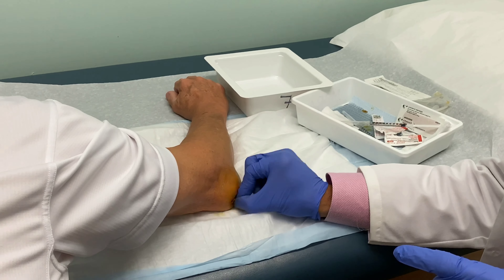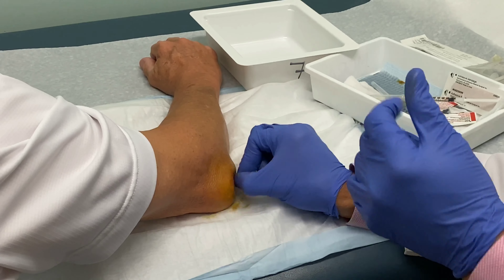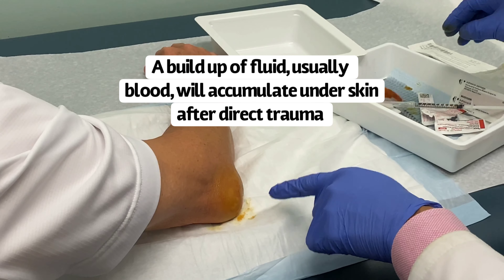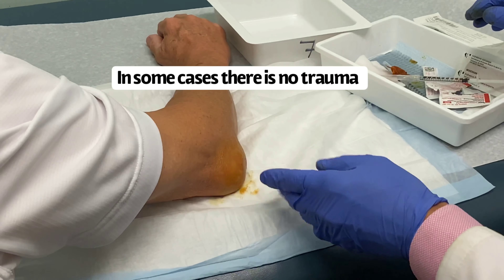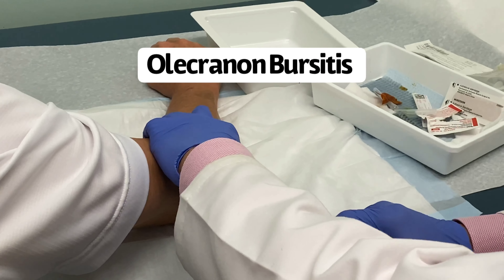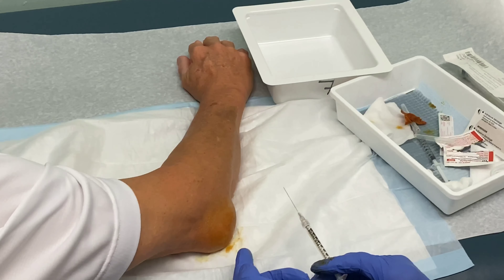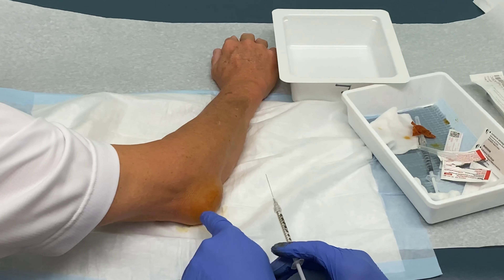Thank you for letting me video this — can I show this on my educational platforms? Yes. This is what happens when you hit your elbow hard on a surface. In this particular case it's traumatic bursitis of the elbow. I'm going to expect most likely blood, so I've already applied alcohol and betadine to this area.